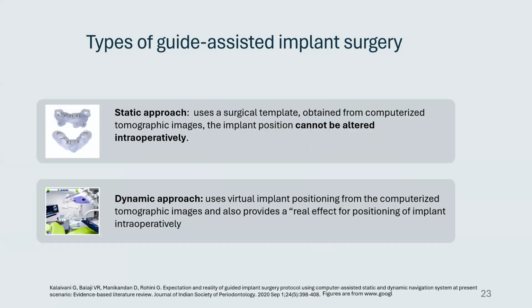For the static approach, we use surgical templates with fixed sleeves or holes in the template, which will guide us to the final position of the implant. And the implant position cannot be altered during the surgery. It's fixed and it's oriented by the sleeves in the template.